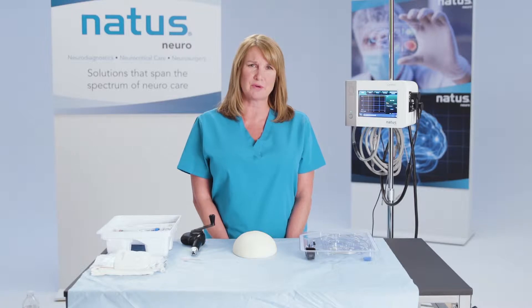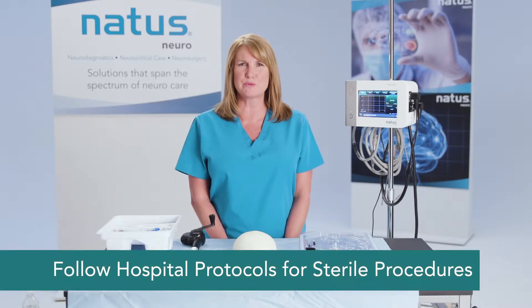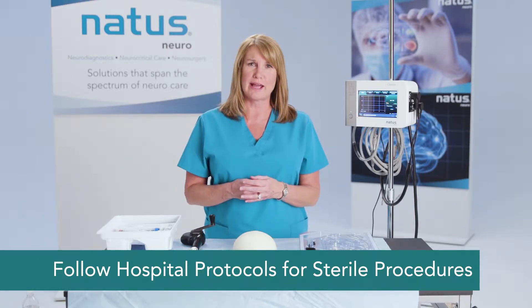I'm now going to demonstrate how to place a 110-4B series fiber optic catheter. Of course, in your hospital setting, this would be a sterile procedure, but for demonstration purposes, I won't be wearing a glove or hat or mask.